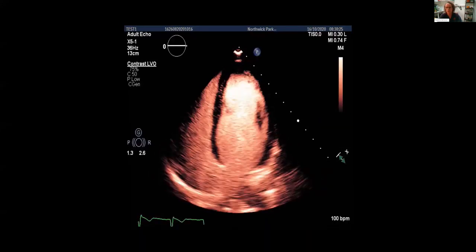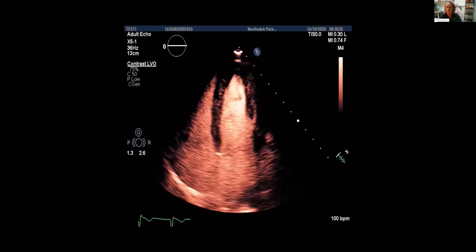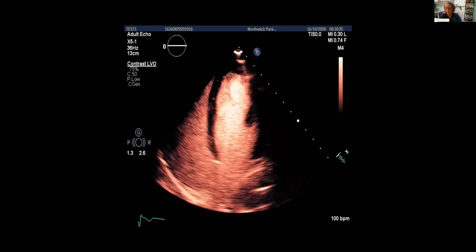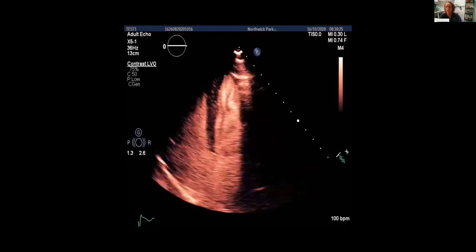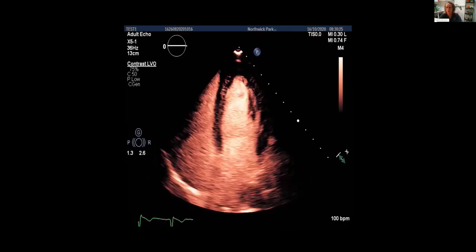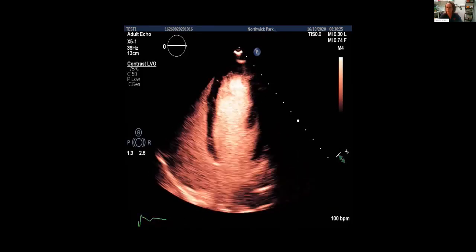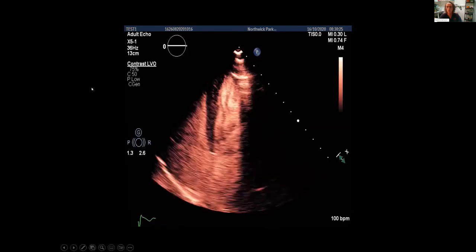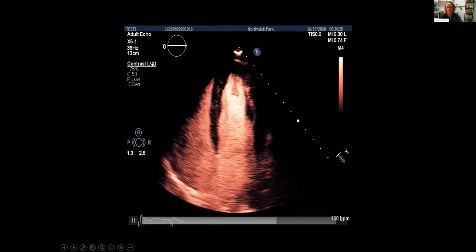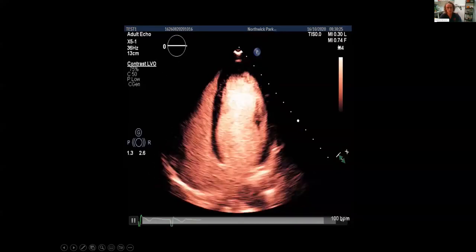In theory, a 3D probe should destroy the contrast more than a 2D probe because there are so many more scan lines. But I'll show you examples of a 2D probe and a 3D probe side by side, and it doesn't always make sense. Our advice is always to try and image with all your probes and see which one gives you the best images. So what settings, what physics is going on here? So at an LVO setting, we are imaging, this is default, I've not changed a single thing here.